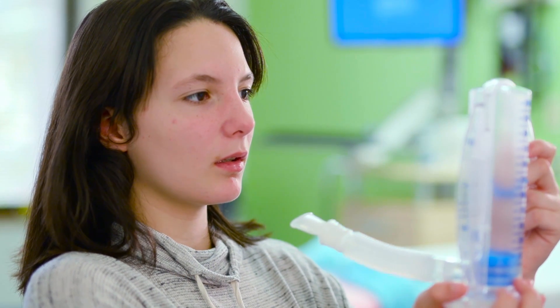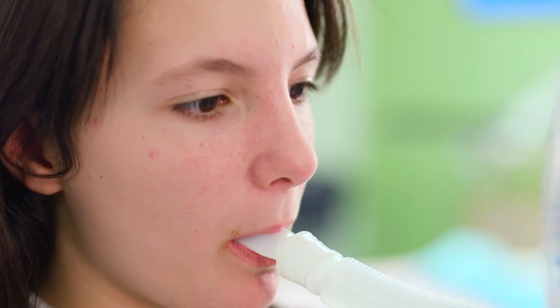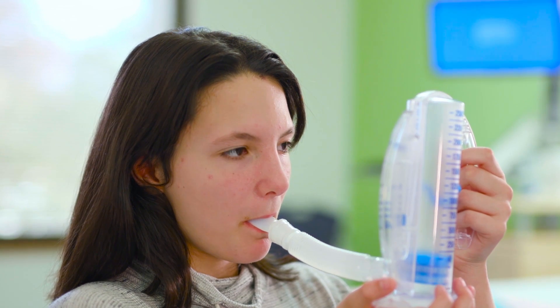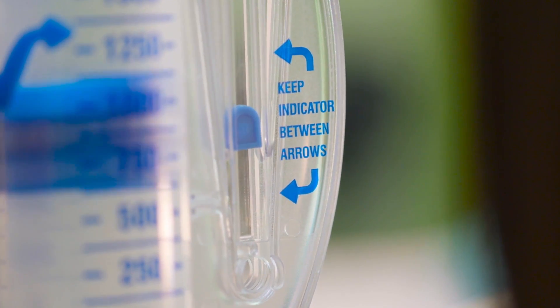Sit up straight and hold the spirometer in your hands. Take a deep breath in and let it out. Place the mouthpiece in your mouth and make sure your lips completely cover the mouthpiece. Breathe in slowly through the mouthpiece like sucking through a straw.